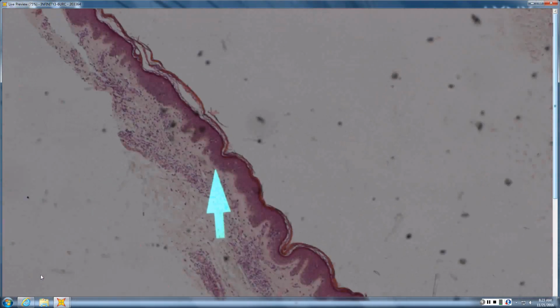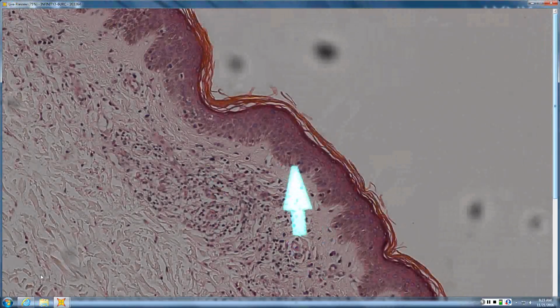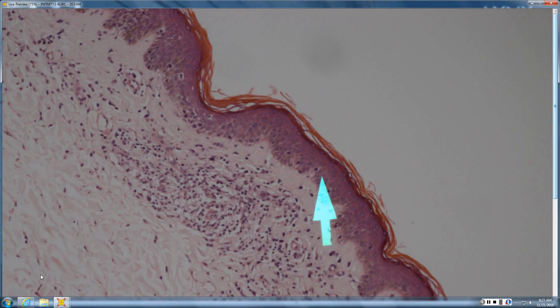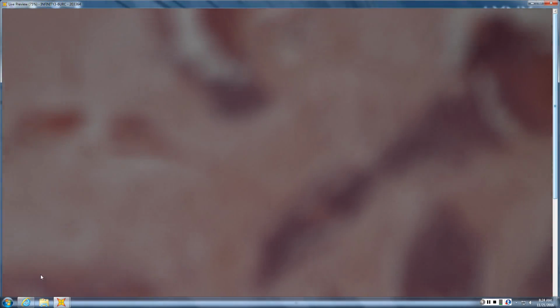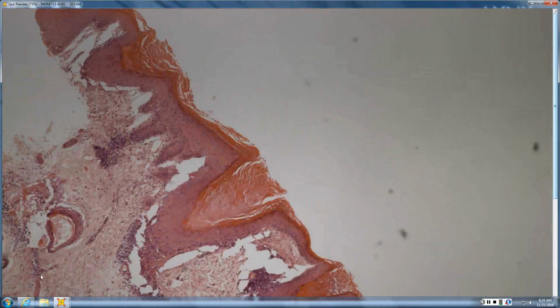I thought this was MF. So you have basilar tagging of large, dark, angulated lymphocytes, papillary dermal fibrosis. When you look at your infiltrate below, it is not so much symmetrically around the vessel, it's more to the top, so you have a little bit of a bare underbelly side. So I would agree with you, MF. Close, man. Okay. After mustard kills it.